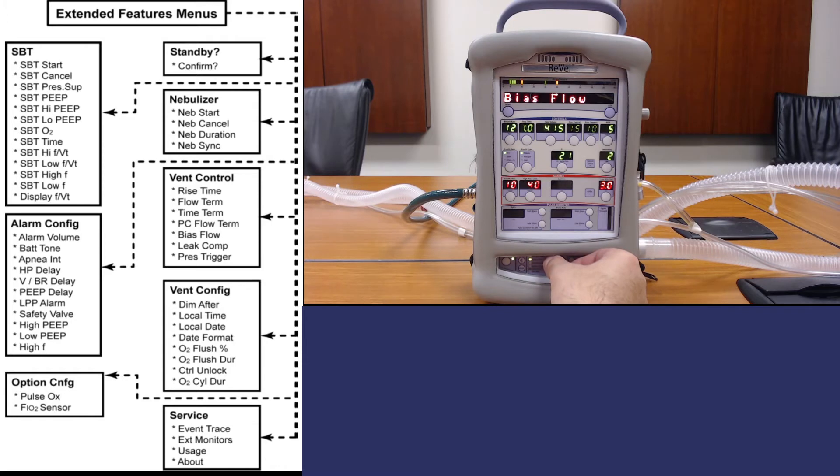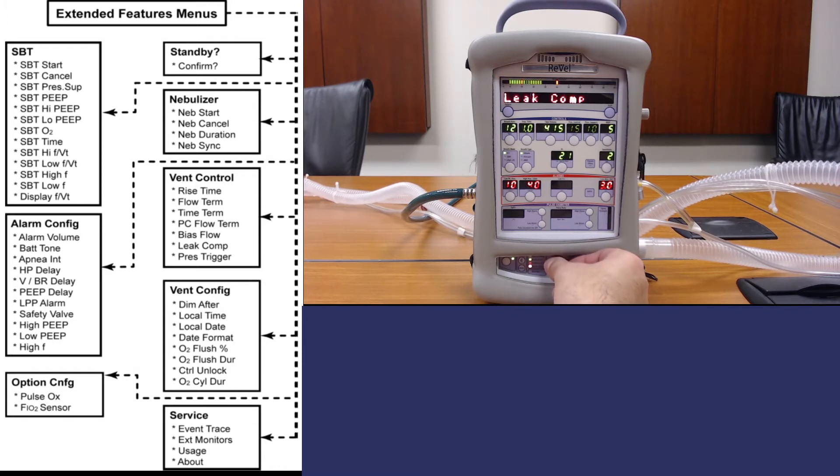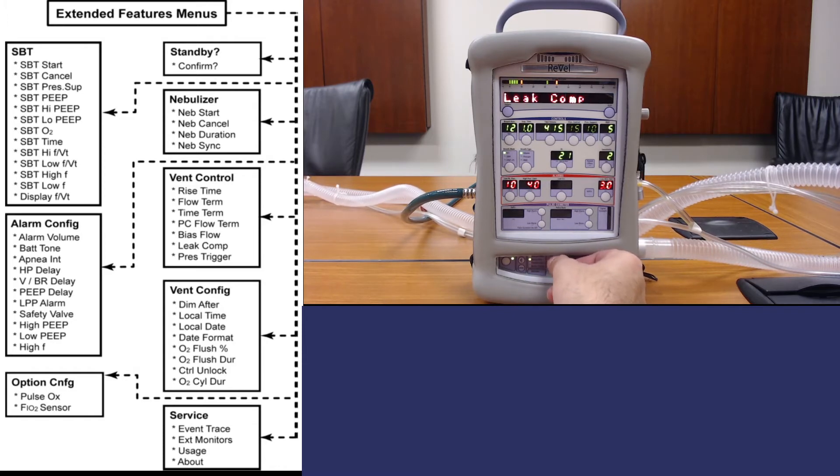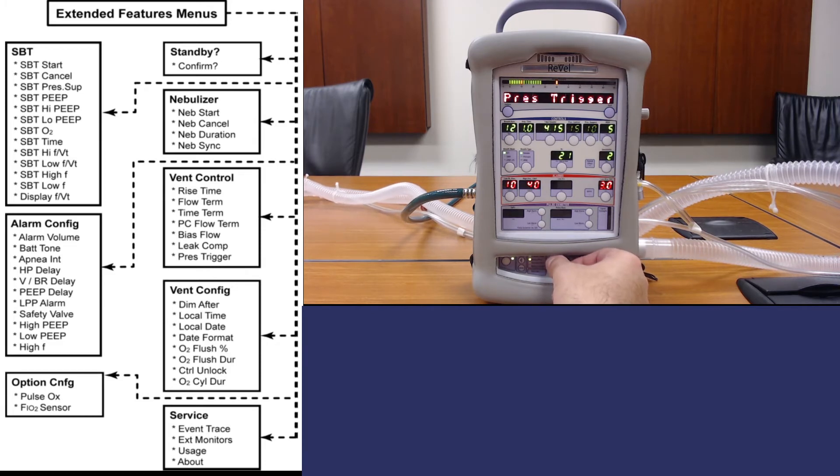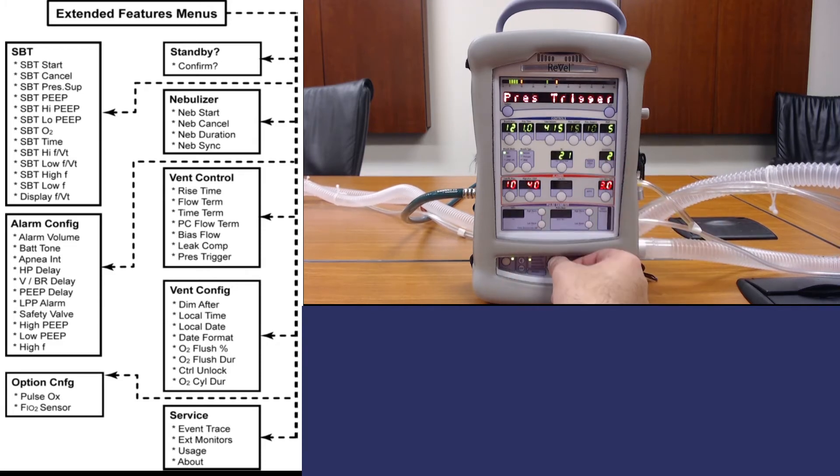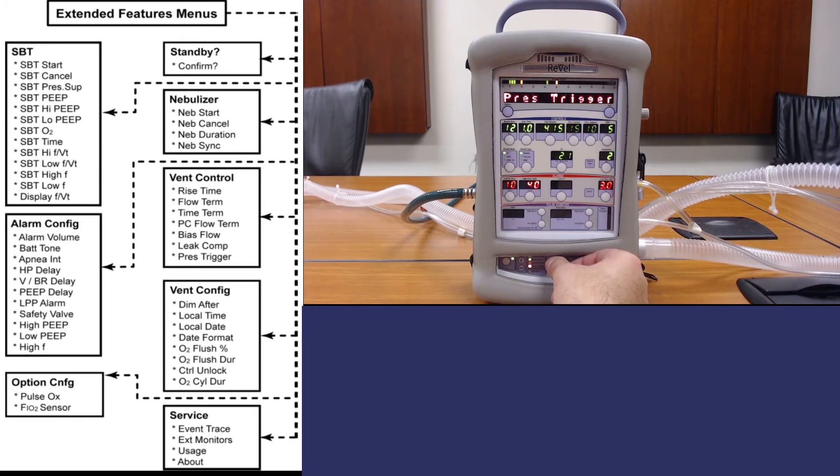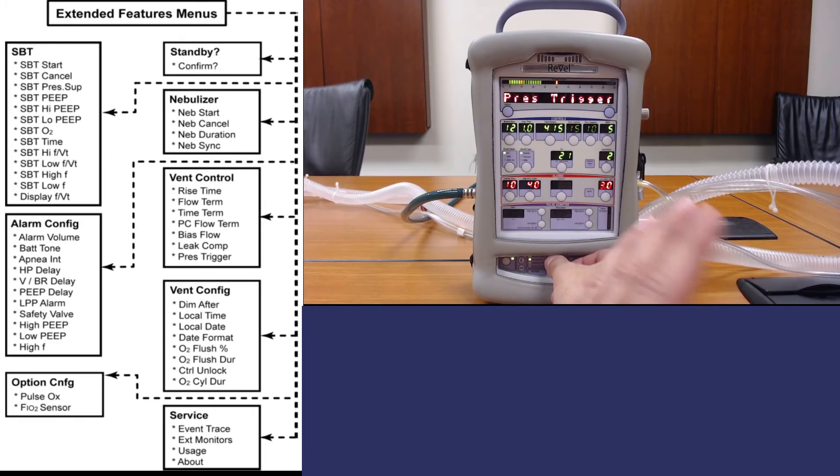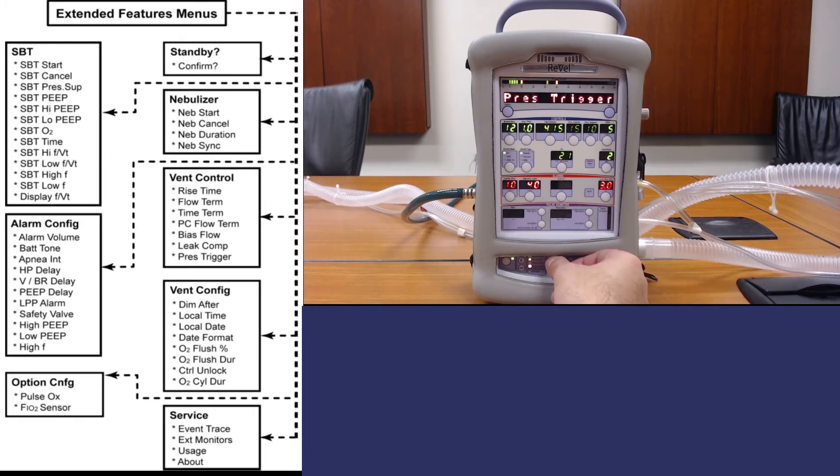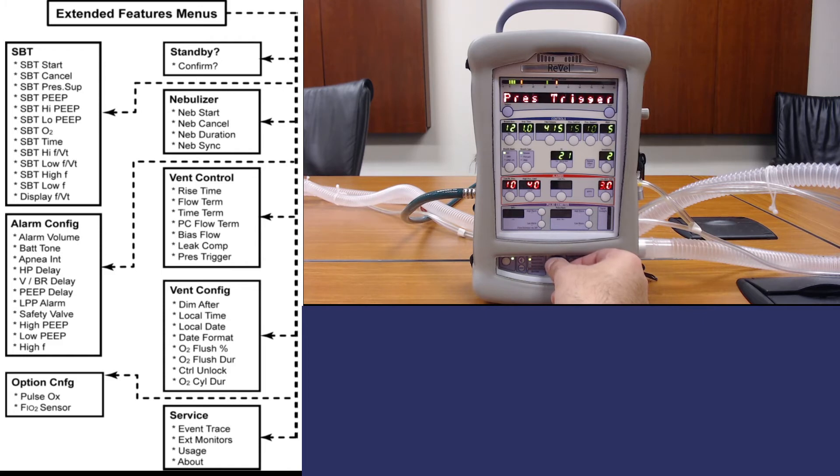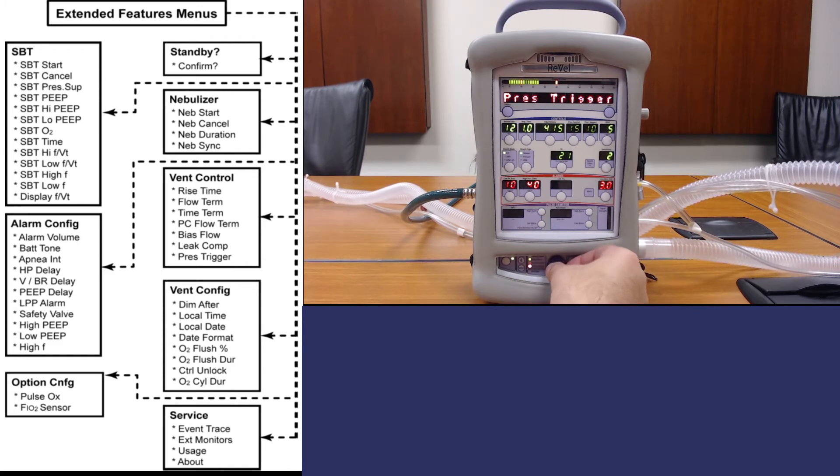Other options include the bias flow, leak compensation, and the pressure trigger. We'll go over some of these items in other videos in relation to specific breath modes and breath types.